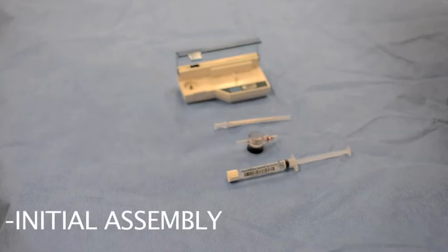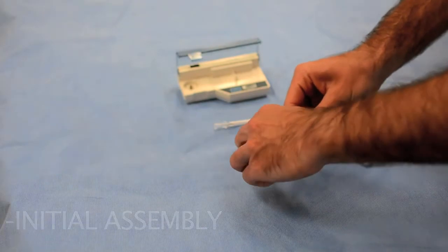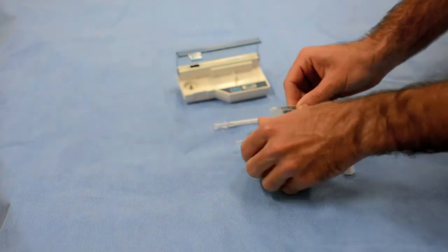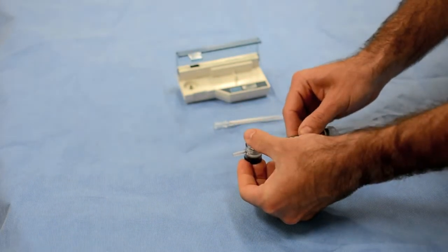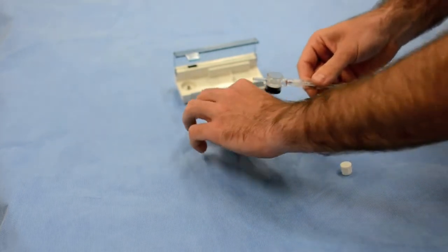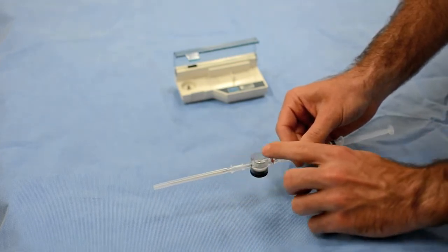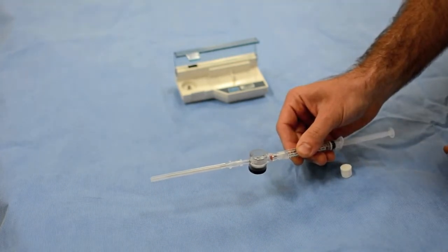The next step is the assembly of the disposable components. Start with your syringe. Maintain sterility of the end of the syringe. Place the coupler onto the syringe, followed by the side port needle. Again, maintain sterility of the needle. Do not contaminate the fluid pathway as of yet.